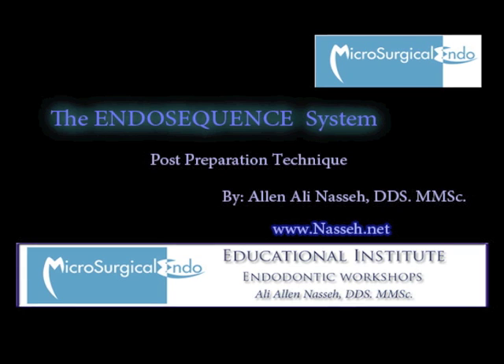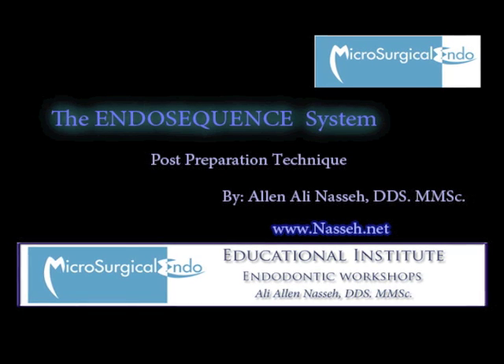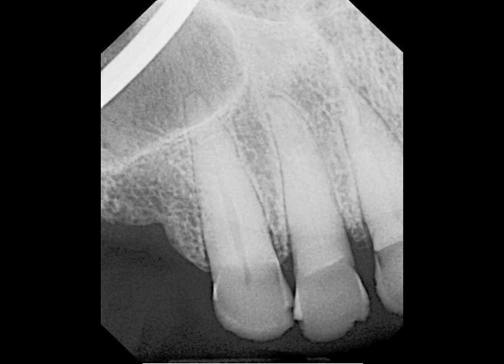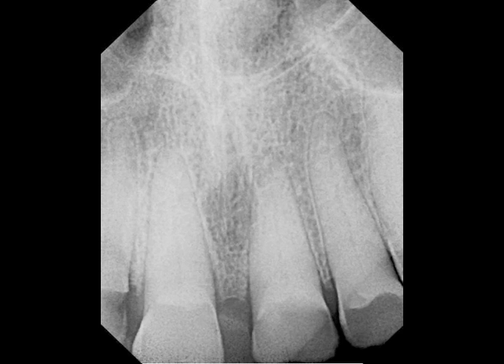Today's case is a more advanced application of this particular post-preparation technique involving multiple teeth. The following patient was referred for pre-prosthetic endodontic therapy on teeth 6 through 11. The six anterior teeth were to be treated due to erosion and attrition on the lingual surface of all teeth.